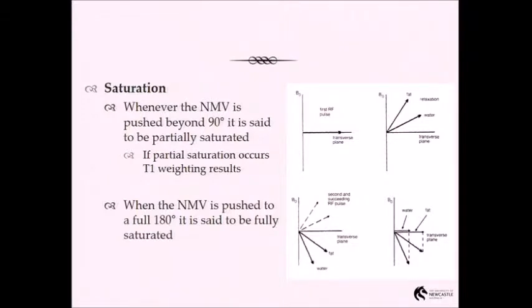One of the things that happens with T1 relaxation times is that the larger the magnetic field strength, the longer the T1 relaxation times become. So I read this paper where people had reported that they'd been doing breast imaging at 1.5 Tesla, started doing it at 3 Tesla and came up with all these weird artifacts that they couldn't explain. I read both papers, their 1.5 and their 3T, and went, hang on a minute, they've used exactly the same parameters. Because the relaxation times had become longer and they'd used the 1.5T experimental setup, they didn't factor in that the relaxation times became longer, and what they were seeing was saturation effects in their images.